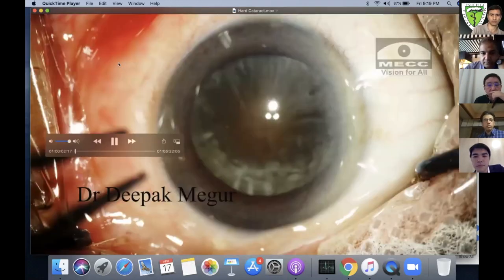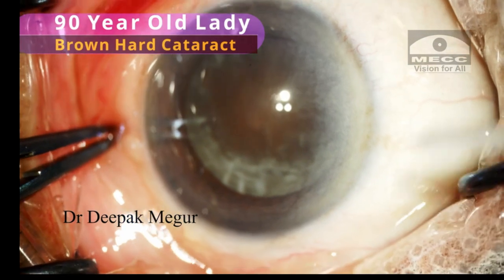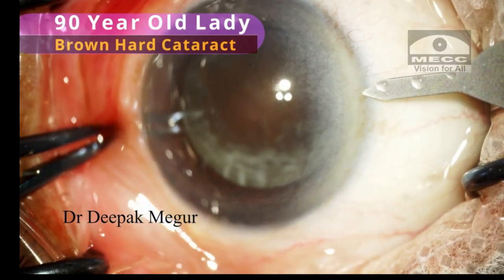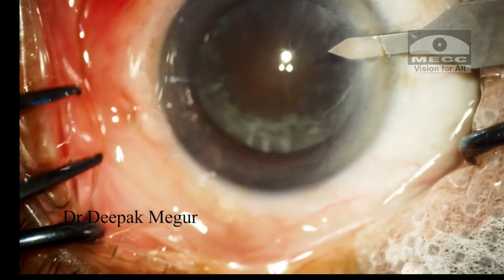Hello, I'll be presenting this case which demonstrates the routine steps in my way of doing cataract surgery. This is a 90-year-old lady with a dense cataract. The surgery is being done under topical anesthesia with some amount of supplementation using a subconjunctival anesthetic.